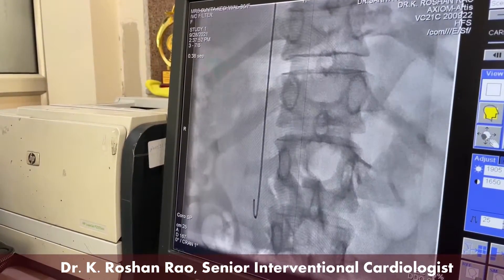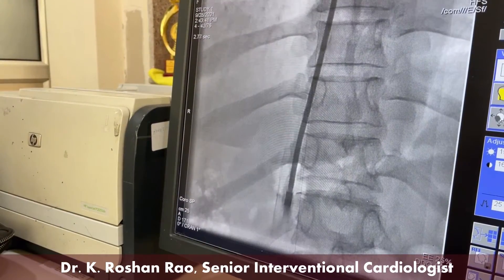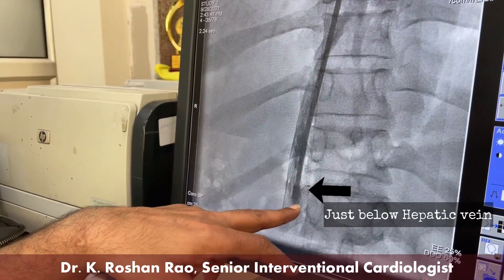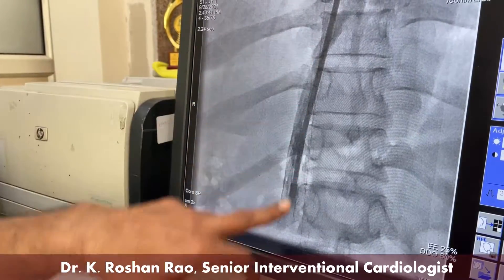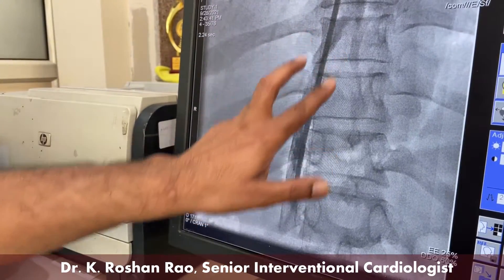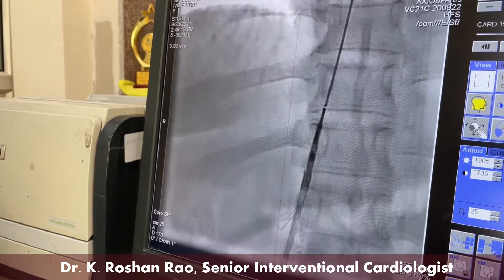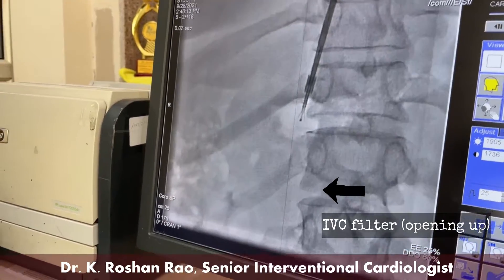We took a shot from the sheath — it was very difficult to pass that sheath. This shot is from just around the hepatic vein, just below the 12th rib. If you see this haziness, these are all clot, and this area is constricted, meaning there is a clot burden here as well.